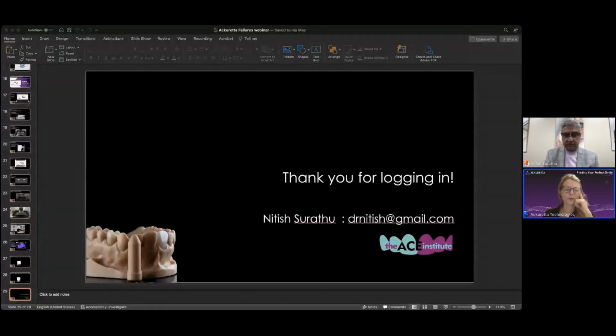Thank you for your really comprehensive overview. You can have a full course on printing failures and all these little things. As for a Z-axis calibration, it is in fact a very simple process to check, but it's very important to do it properly, because if you don't calibrate the Z-axis properly and then you start a print, you may cause bigger damage. So if you have any suspicion in terms of that, always just send us a message.